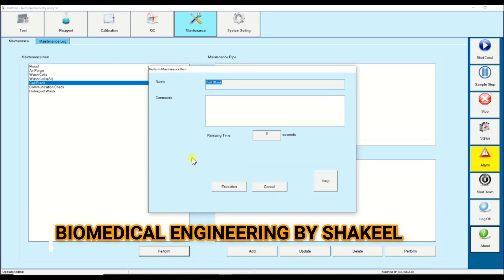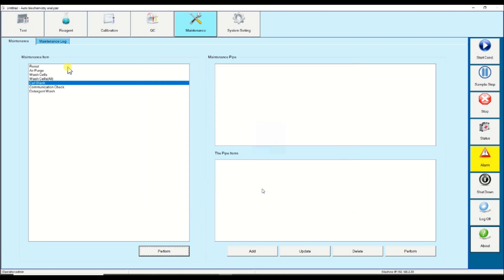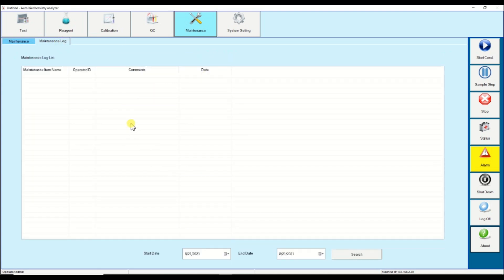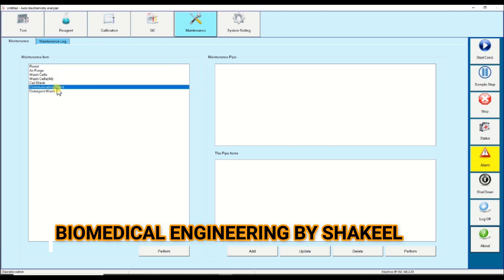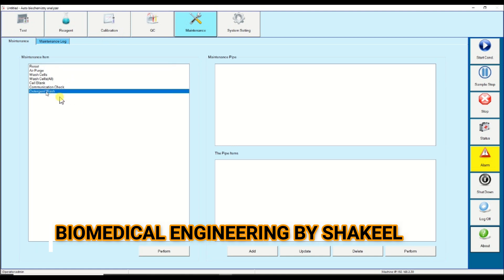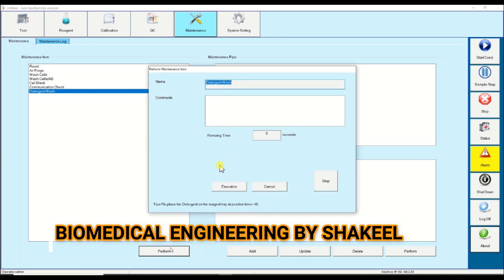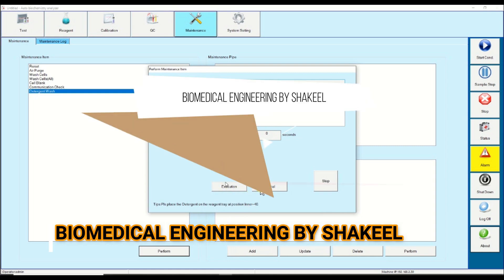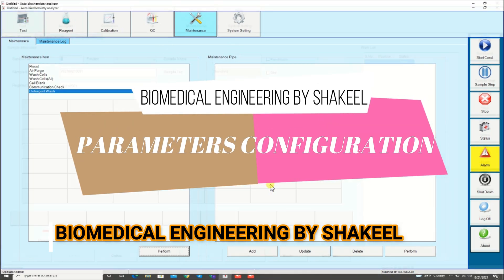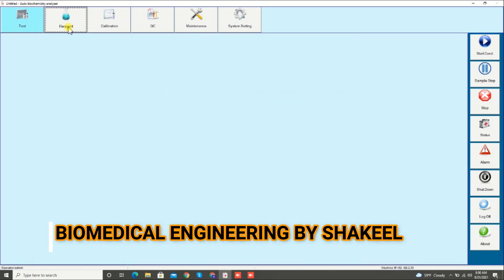The next step is cell blank — if you want to check the absorbance of all the cuvettes, the machine will check each one. There is also an option to check the communication between the analyzer and CPU. The last option is detergent wash — if you want to wash the machine with detergent, you execute this.